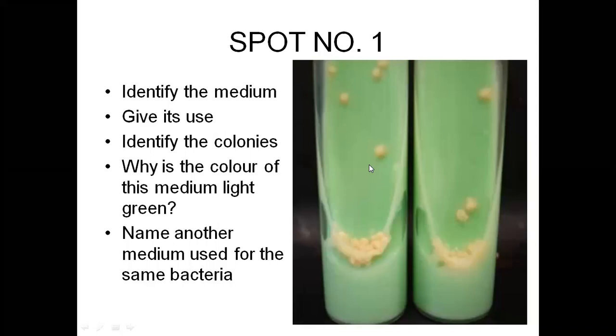It is written in the book, armadillo. So for the first time the armadillo was used for culturing this, but nowadays we can culture this artificially in the lab, in mice or rats, and on artificial tissue culture also. So give its use, it is media for mycobacterial species.